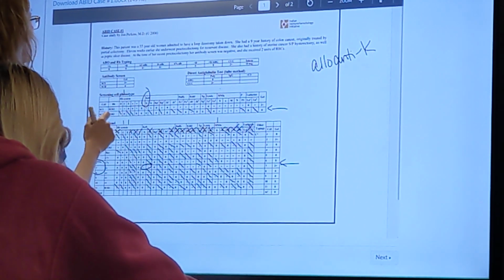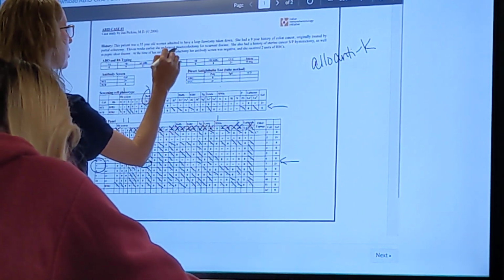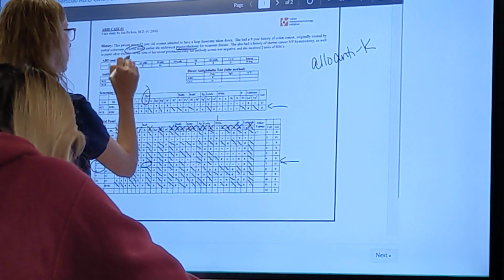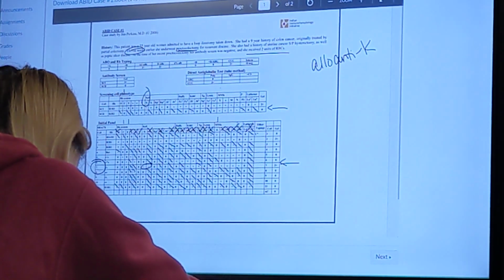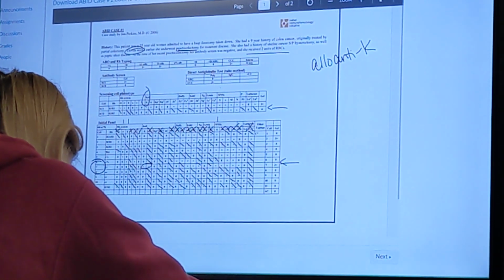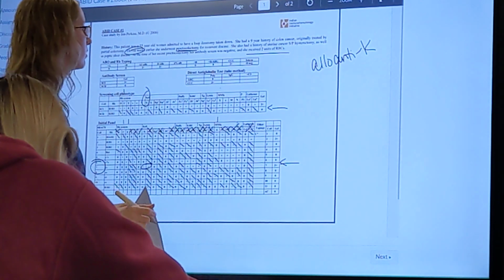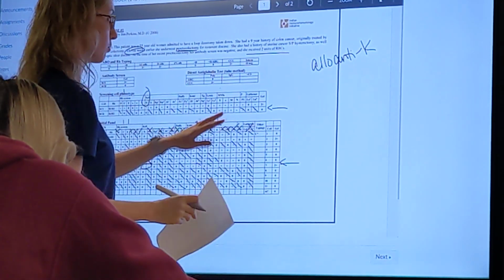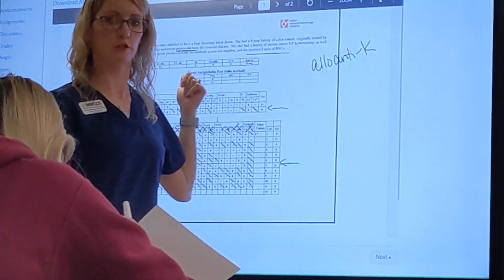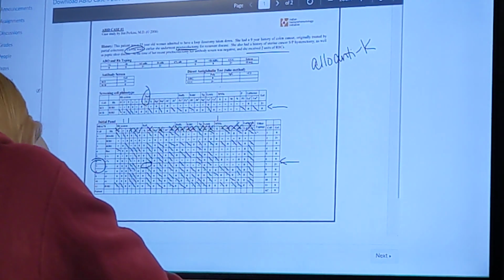Is it 11 weeks earlier? Oh yeah. So at this surgery, which was 11 weeks ago, she got 2 units of blood. So that's what we're saying, she's O negative, recently transfused. So it's an allo antibody. She got 2 units of blood, and 11 weeks is plenty of time to make an antibody, so she has an antibody.